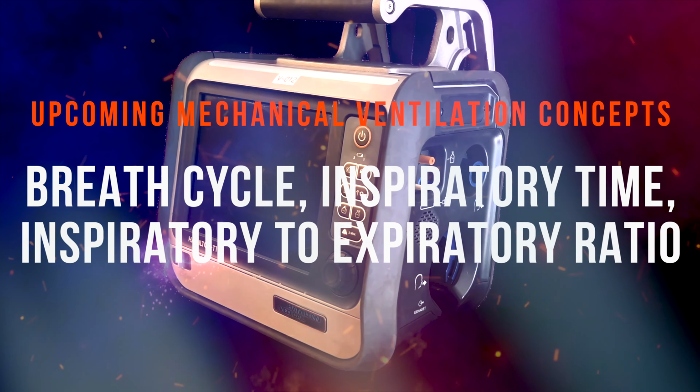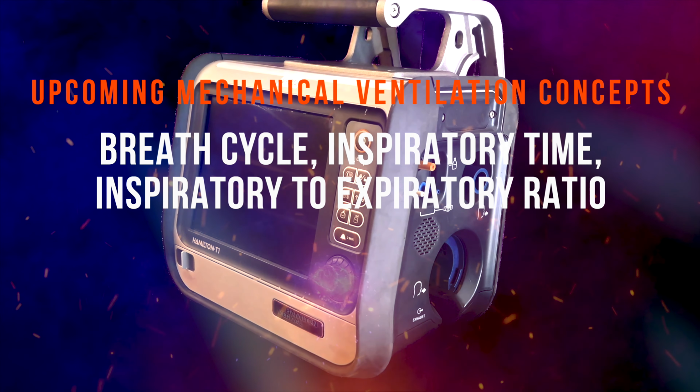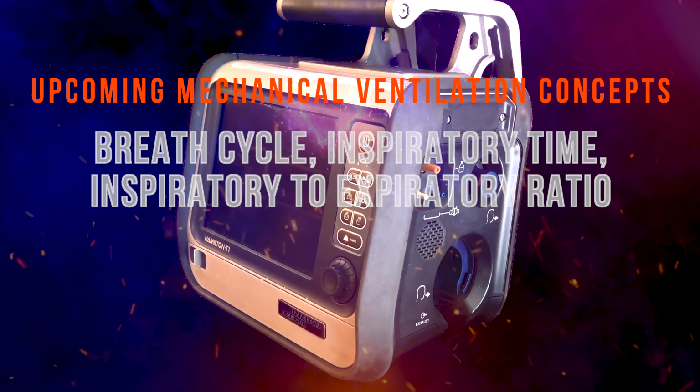Exploring the breath cycle, inspiratory time, and inspiratory to expiratory ratio are closely linked to ventilation frequency and tidal volume. I will cover those related topics in detail in a subsequent module.